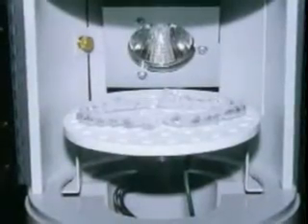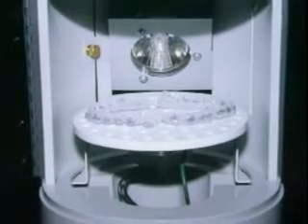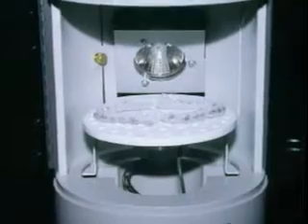The tray should now be fully exposed to the light chamber for 1 minute, or an Ortholux XT curing light for 5 seconds per bracket to completely cure the custom resin base.